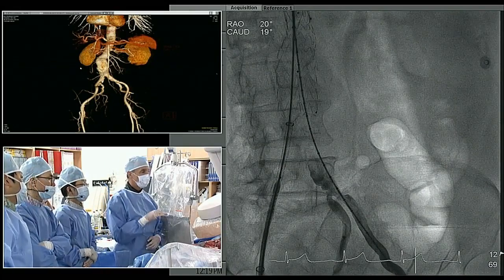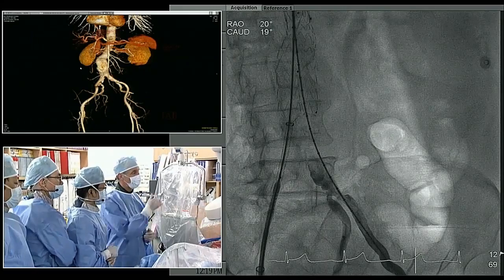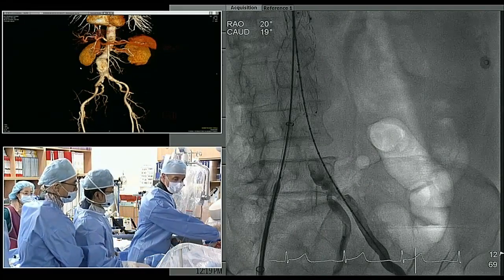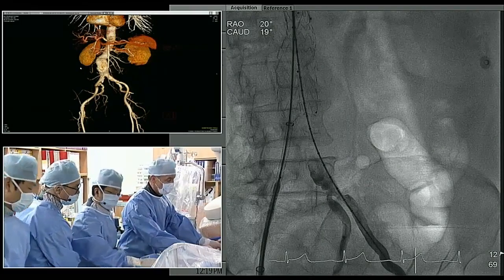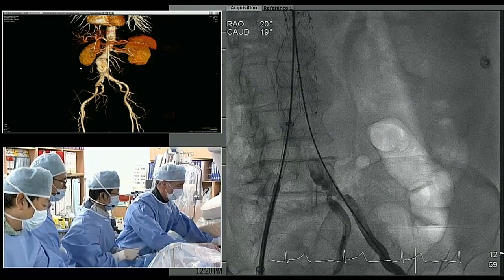We have 6 to the bottom measured. Yes. And then we have a 93, so that'll be a perfect overlap. Sounds good. We have inserted now the appropriate sheath here, and we're going to go ahead and put that device in.